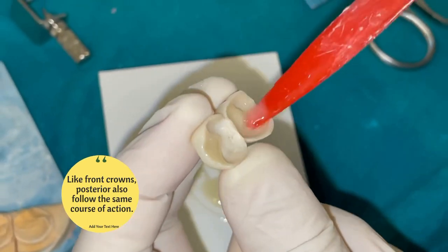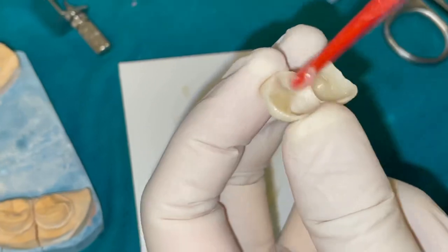These are the posterior crowns — we will fix them in the same way as the front caps were fixed.